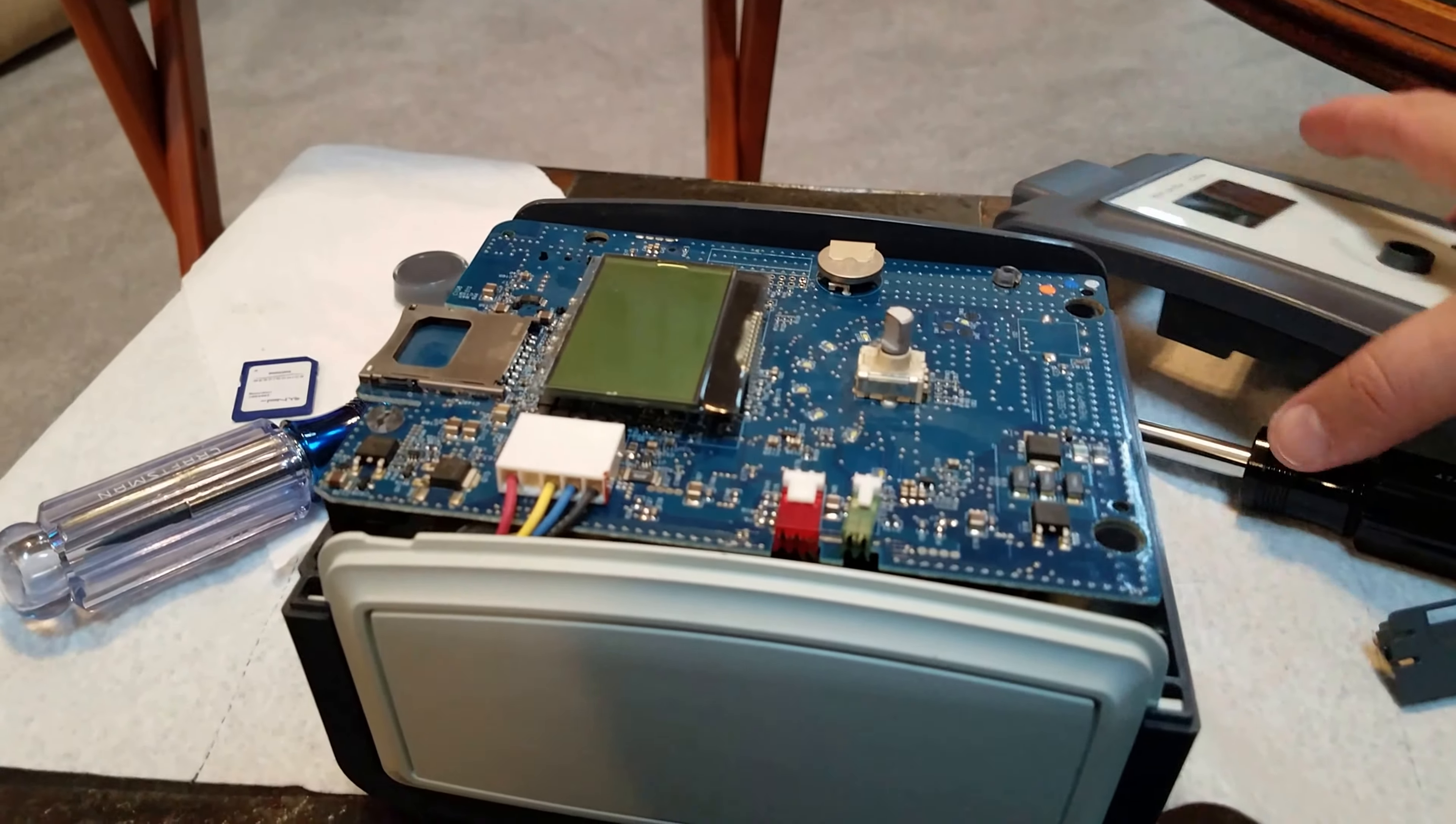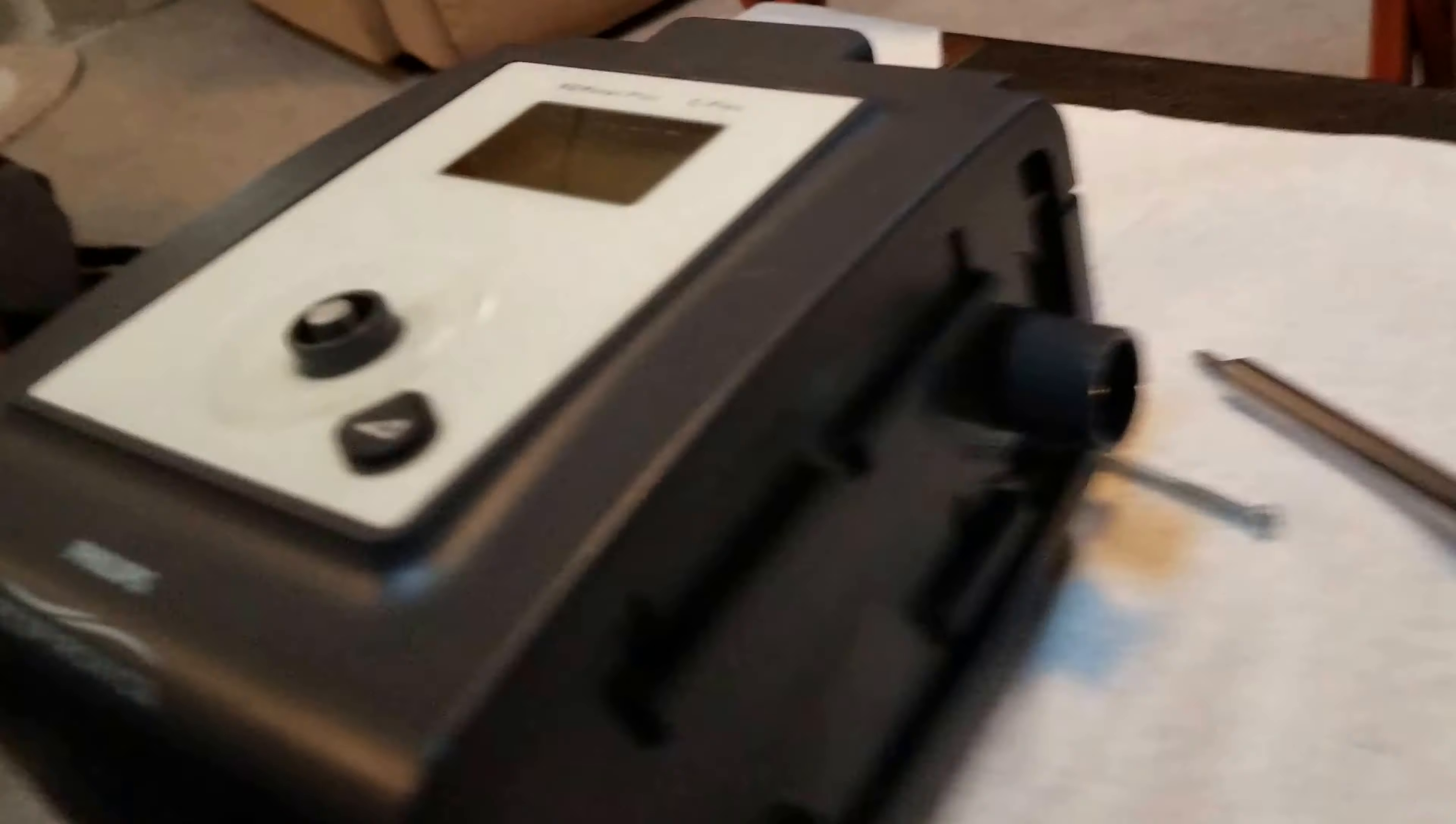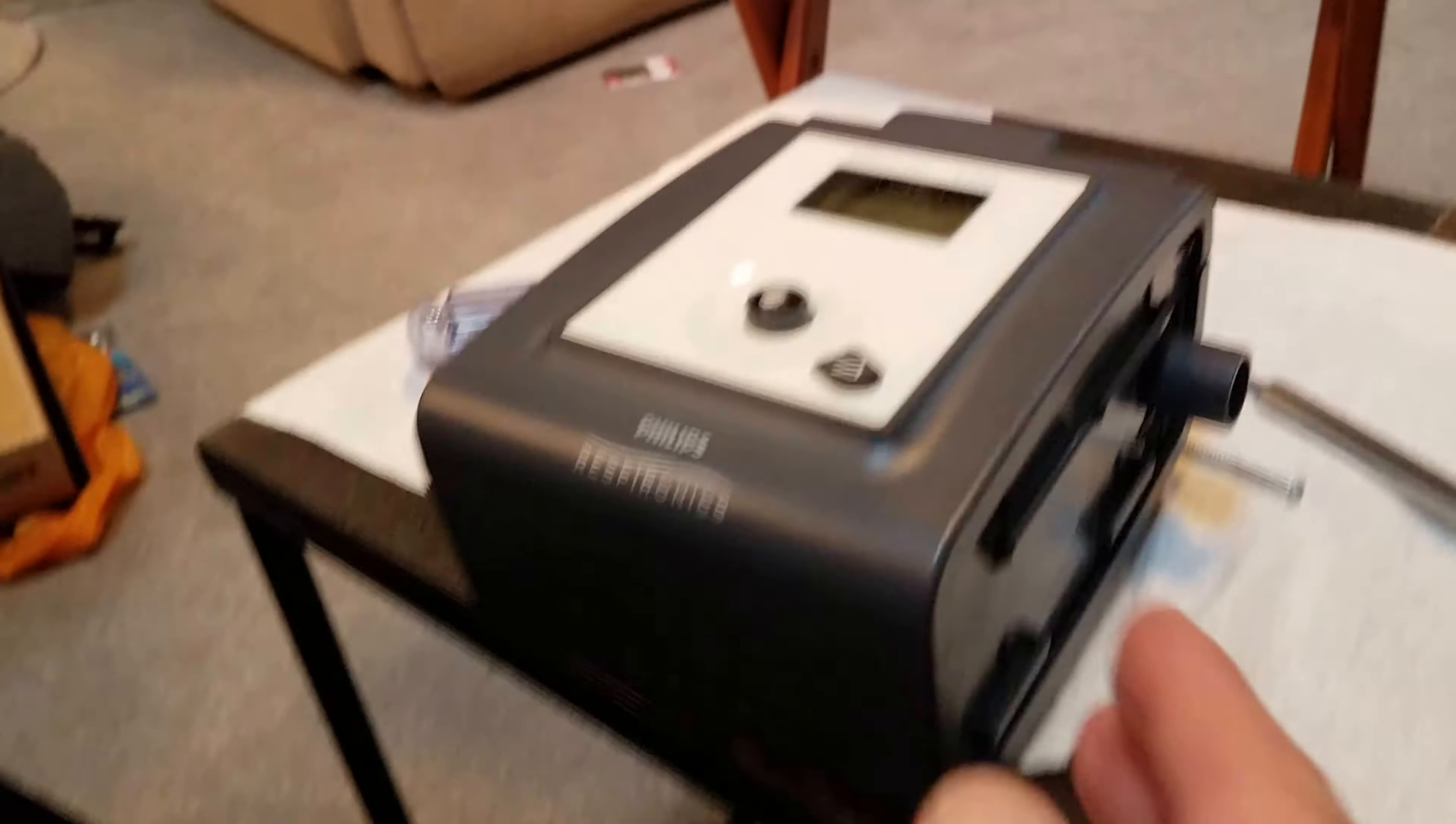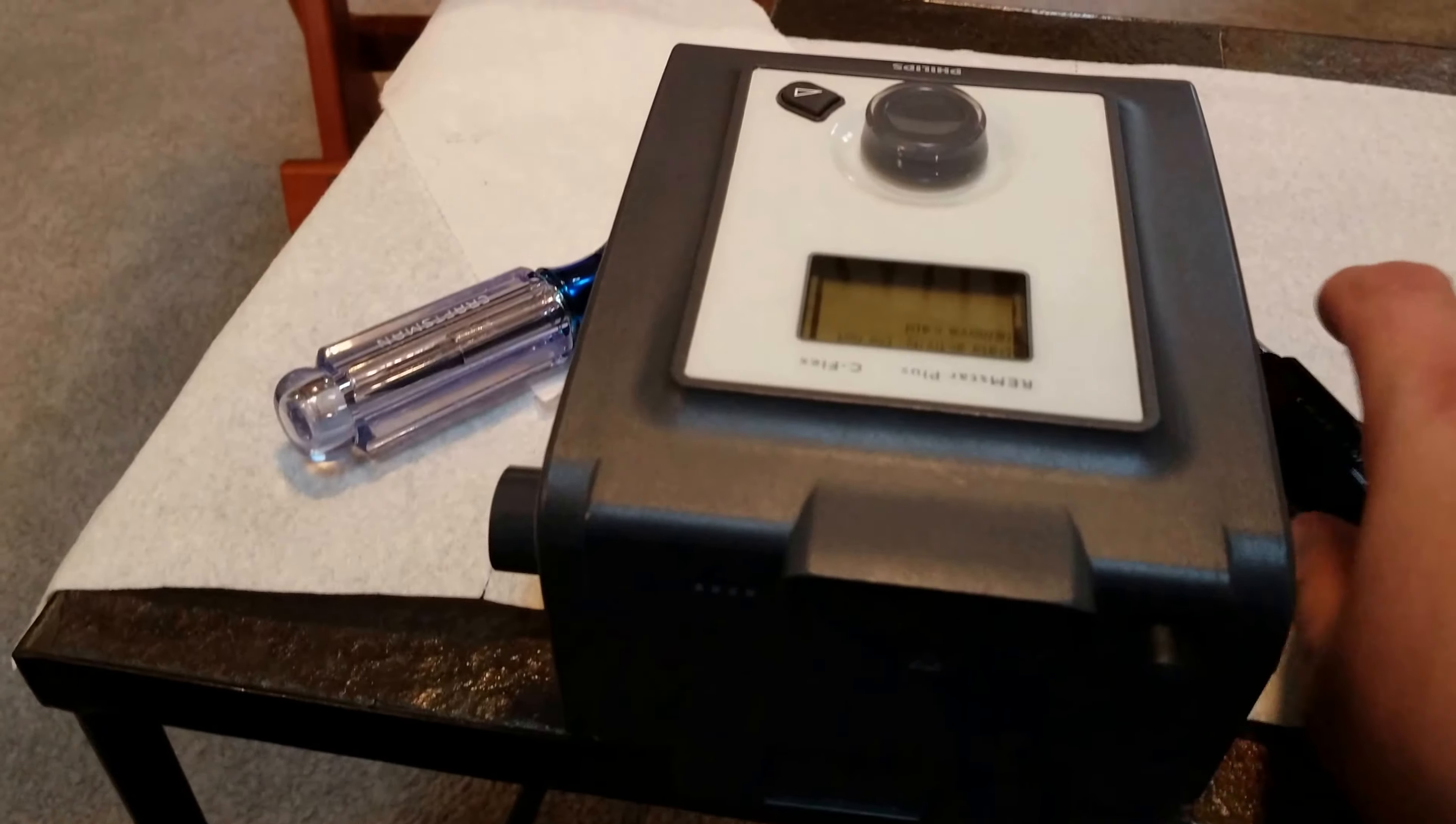You do not absolutely need this on your unit, just to keep the dust and everything from outside of it. This is the side that you hook up the humidifier to if you want to do that. You do not need the dust cover on that, it won't work with the humidifier if you have the dust cover on. This side I use it just without, because there's no sense and there's no real reason to have it on there in my opinion.